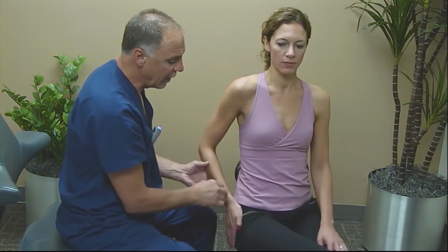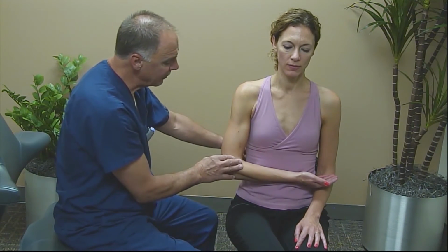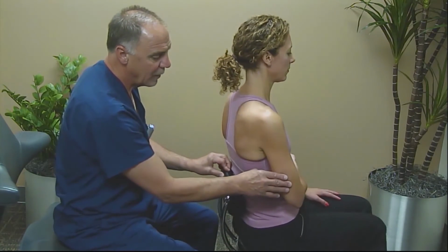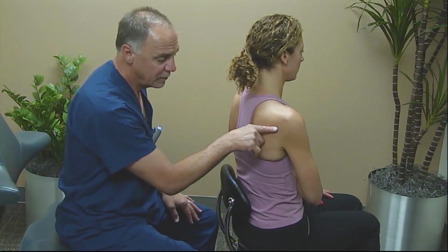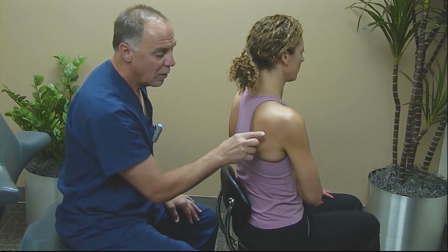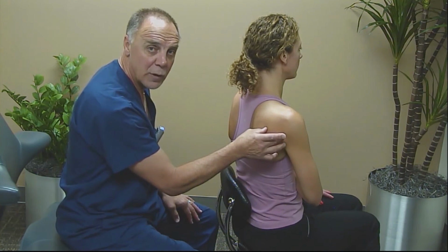Now, the next position that we want to get in, and we'll start with the patient back in the neutral position, is I tell the patient, put your arm like it's in a sling, 90 degrees with the palm up, with the arm lying against the tummy. What this does is allow us exposure of the posterior aspect and the last structures that we're going to take a look at. Number one being the infraspinatus tendon. Second structure, the teres minor. Third structure will be the spinoglenoid notch and posterior superior glenoid labrum.